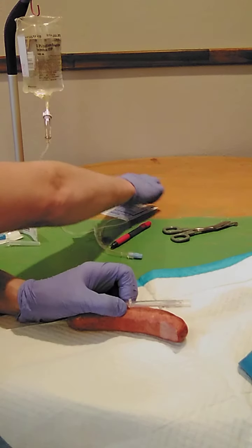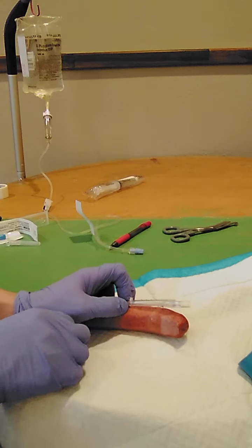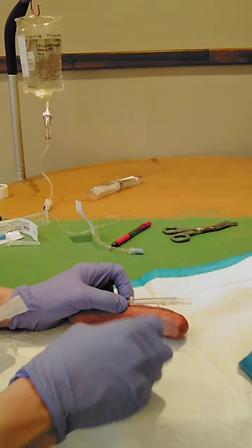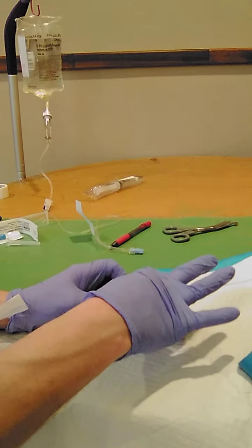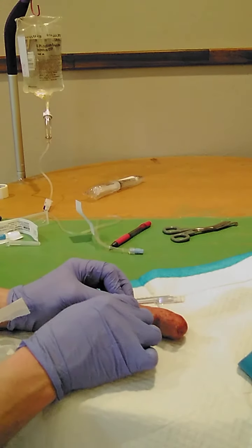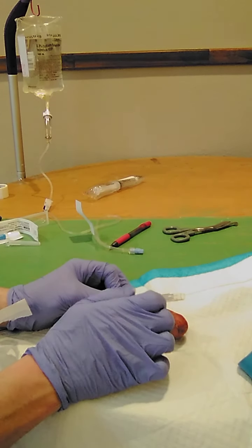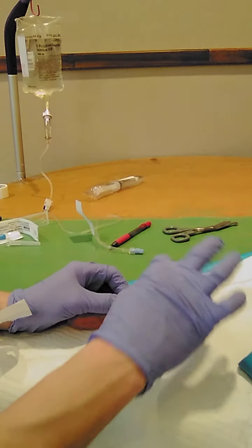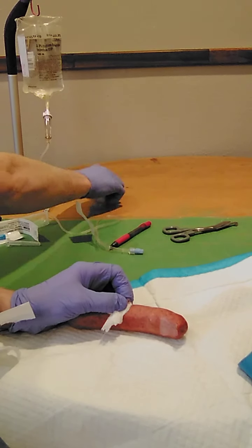Now I'm going to obtain a piece of gauze. I'm going to place this clean gauze between the hub of the catheter and the skin. Okay, and I have pressure on that now. So now I can remove that, and I can go towards the sharps container.